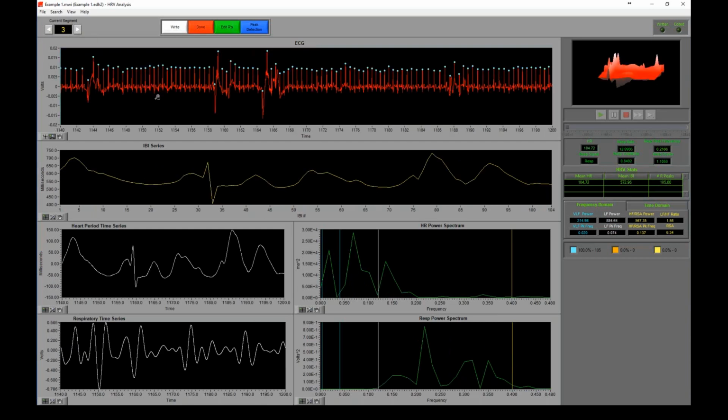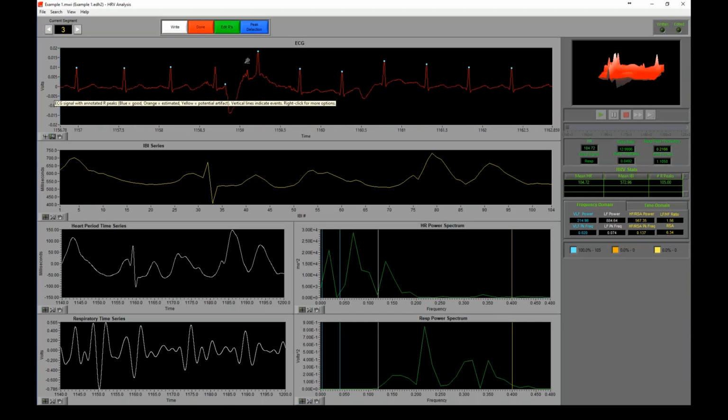Okay, so same situation here. We have some data that looks a little odd from this far out, but everything's being flagged as a proper R peak. So we should at least zoom in just to make sure that that is the case. So, horizontal zoom tool, dragging across, and here we see that that's not the case. Even though this peak meets the timing criteria, it's very obviously not on the actual R peak. And that's just because of this motion artifact tripping up the peak detector.